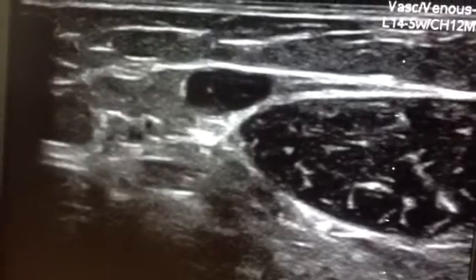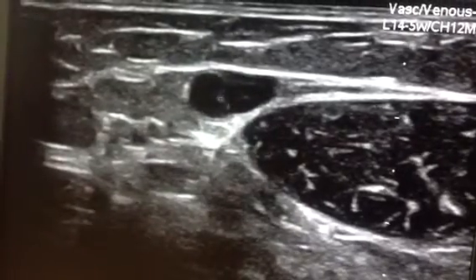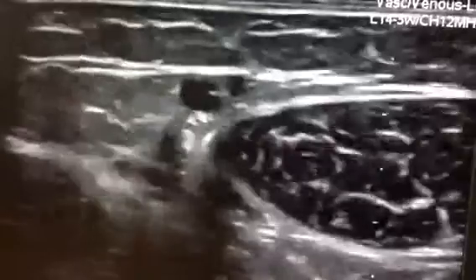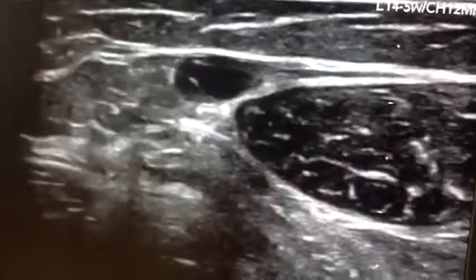Okay, this is an incompetent valve in a dilated vein just below the knee. This is proximal. That's distal. And there is the incompetent valve.